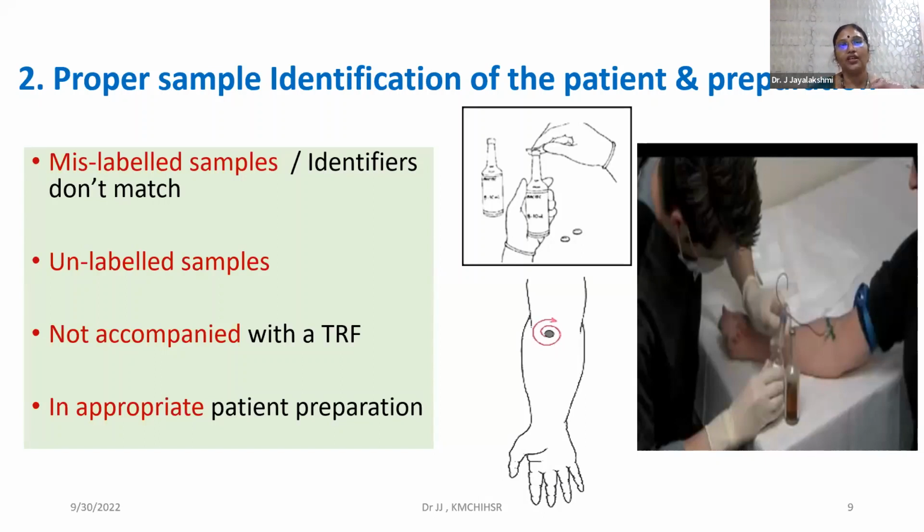So you need to have your patient preparation done well. The best example would be blood sample collection for blood culture. So it's important that you decontaminate the site very well, and then collect appropriately and not palpate it again.